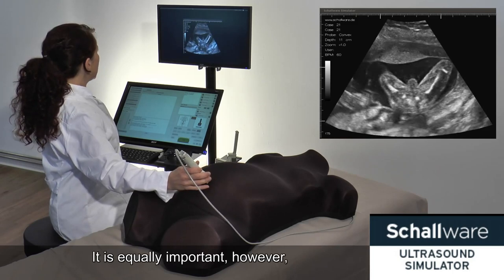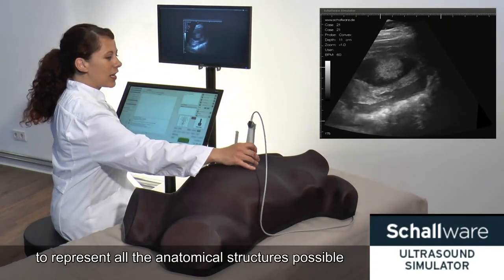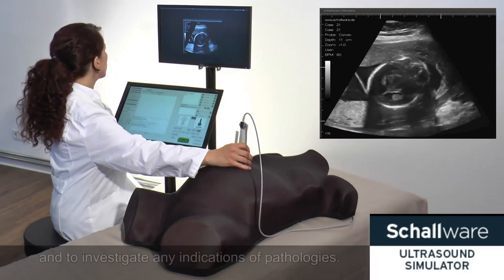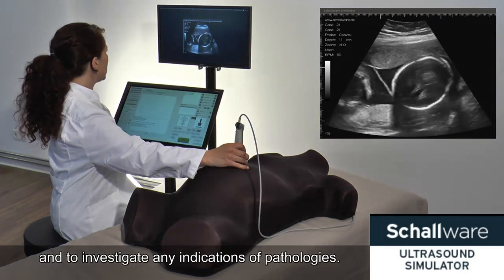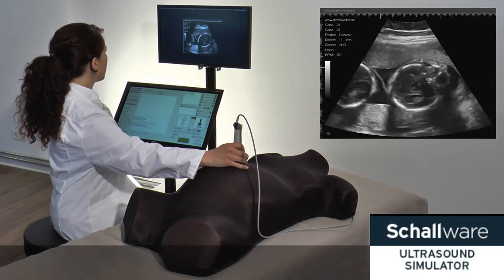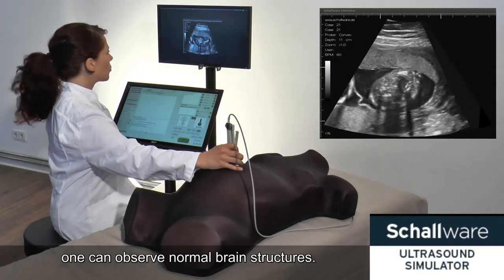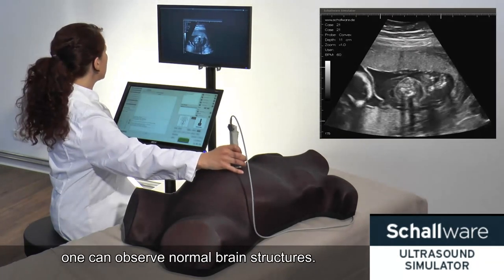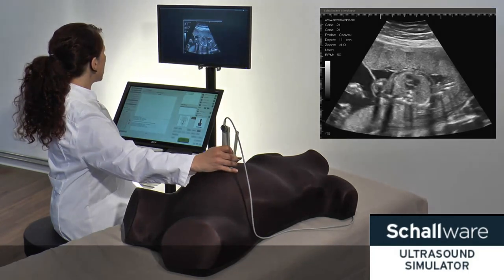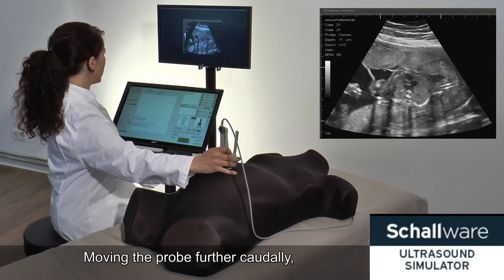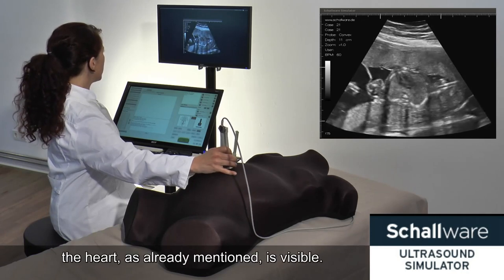It is equally important, however, to represent all the anatomical structures possible and to investigate any indications of pathologies. If you look closely at the head, one can observe normal brain structures. Moving the probe further cranially, the heart, as already mentioned, is visible.